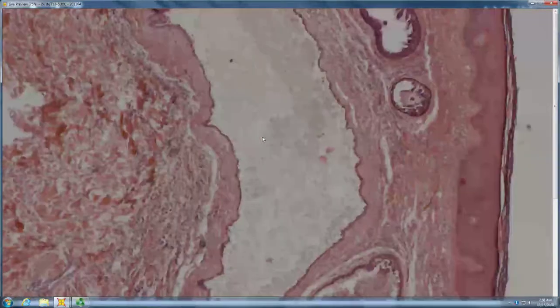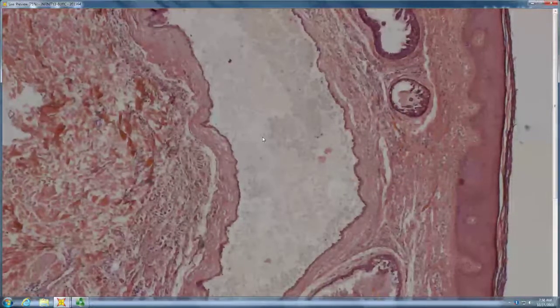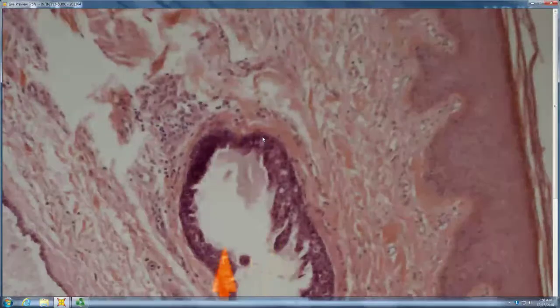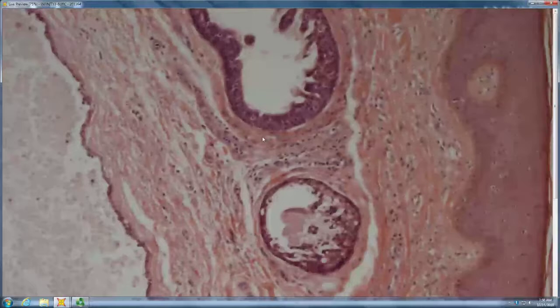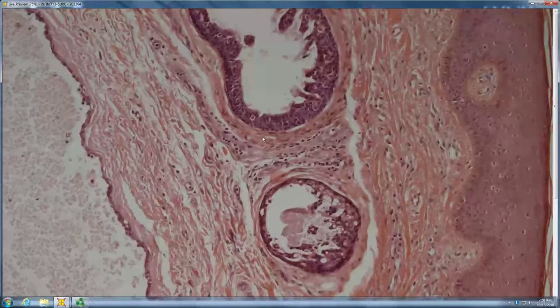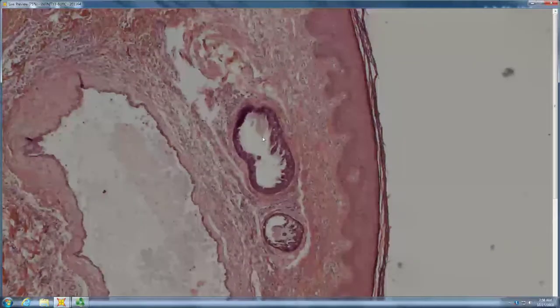Cyst-like structure, and what's in the wall of the cyst-like structure? Papillary structure. Yep, papillary fronds, Roman arches. So PETA: if it's dorsum of hand or foot, PETA, which stands for papillary eccrine adenoma or tubular apocrine adenoma. If it's head and neck, probably just benign cystadenoma.